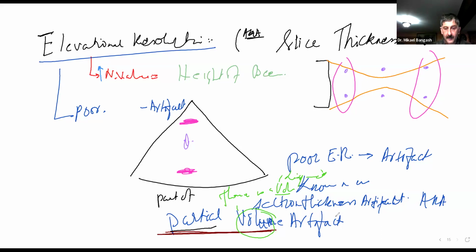So we'll see a partial volume artifact, which is due to a poor elevation resolution.